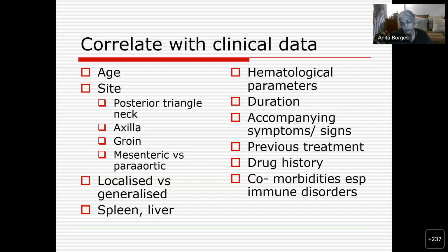So tuberculosis, toxoplasmosis, some reactive lymph node because there is dandruff in the scalp, or some other such reason for why a lymph node is swollen in the posterior triangle. So be a little careful about making some exotic lymphoma diagnosis in the posterior triangle, particularly a diagnosis of Hodgkin's lymphoma, because toxoplasmosis is so common in the posterior triangle.